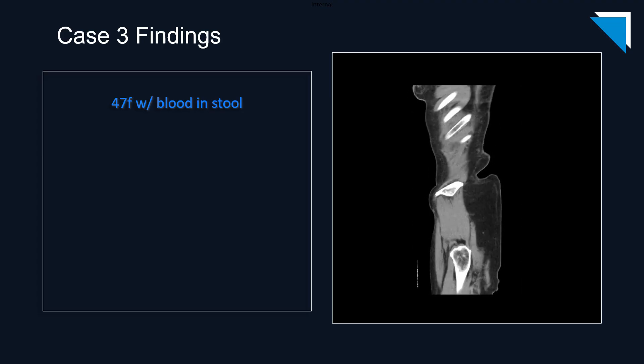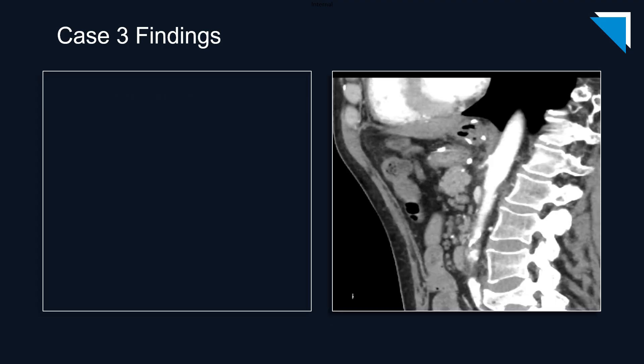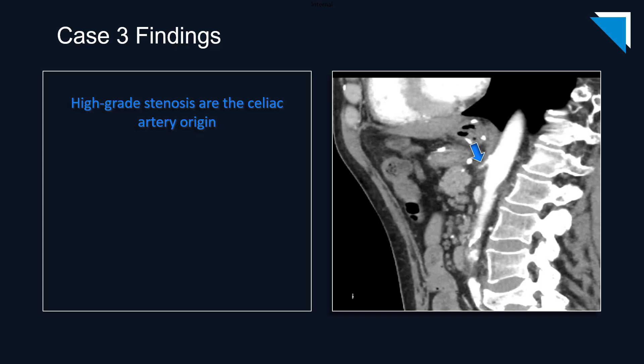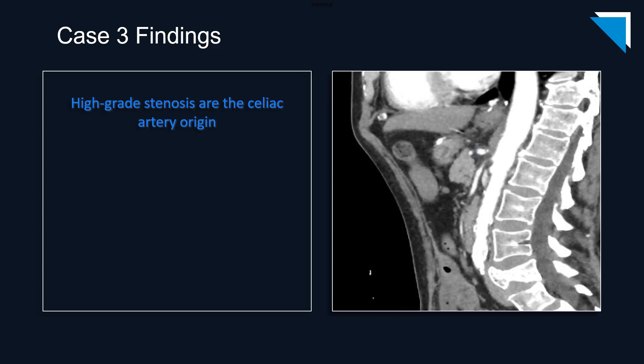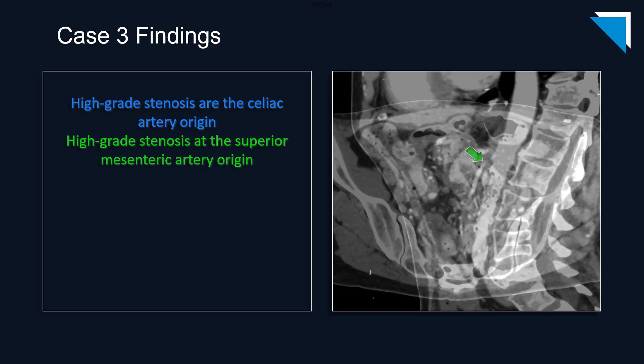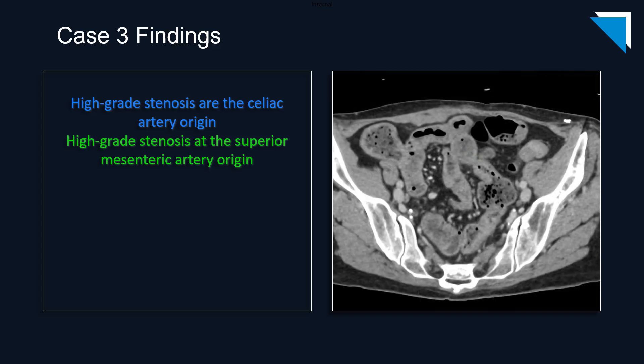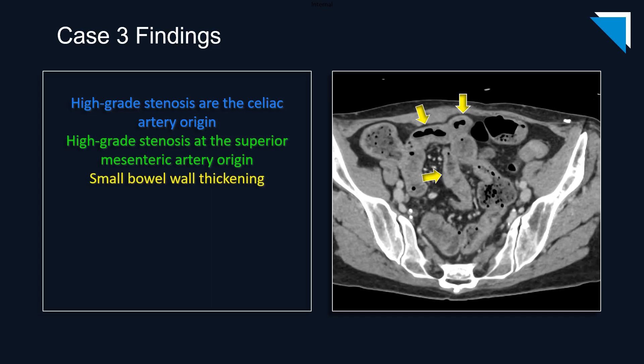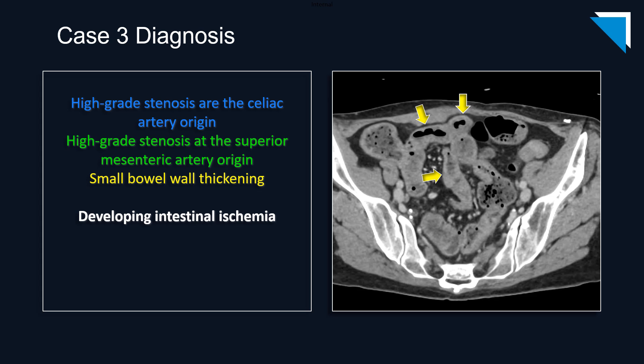Let's cone down on a couple of the sagittal images from this examination. There is high grade stenosis at the origin of the celiac artery, with a similar appearance at the origin of the superior mesenteric artery. I'll ask you to trust me that the inferior mesenteric artery was similarly narrowed. I hope I can convince you that there is some mild small bowel wall thickening on this axial image at the level of the pelvis, which in concert with the mesenteric arterial findings raises concern for developing intestinal ischemia.